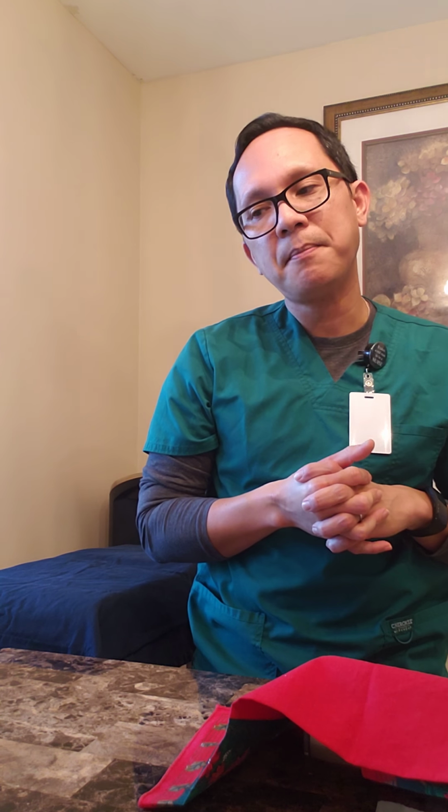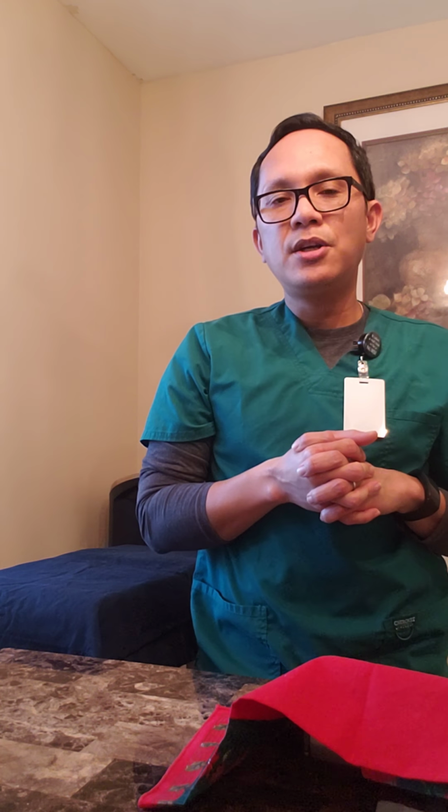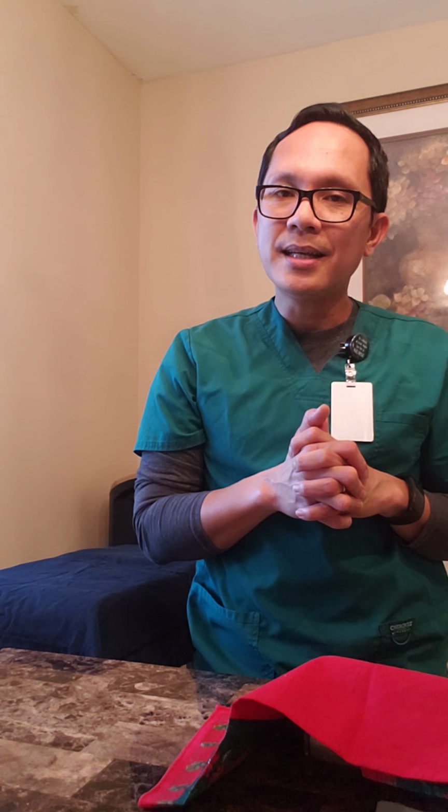I'm also going to be educating the patient as to how the Foley insertion is going to be done. I'm going to let her know that the insertion is not going to take long, but she will feel a little pressure, and I'm going to be inflating a balloon after we put it in. And of course, before we do the procedure, we're going to be exposing some private areas of her. Once I did all of that, now I'm ready to go and gather all my supplies.